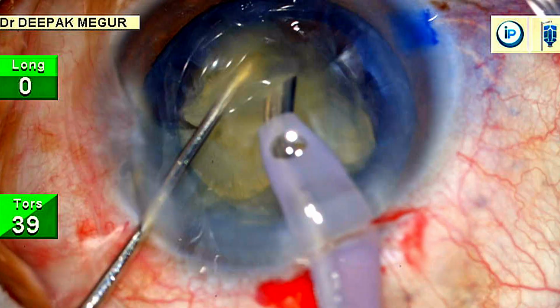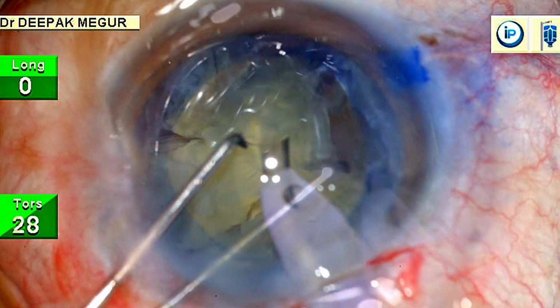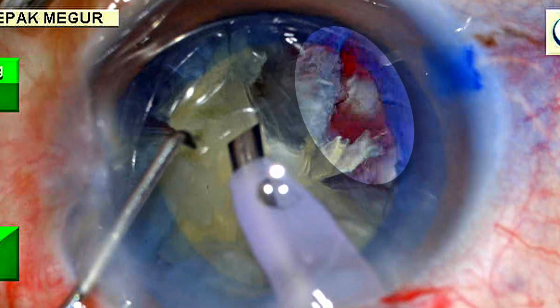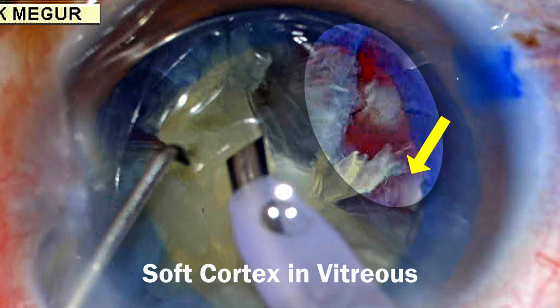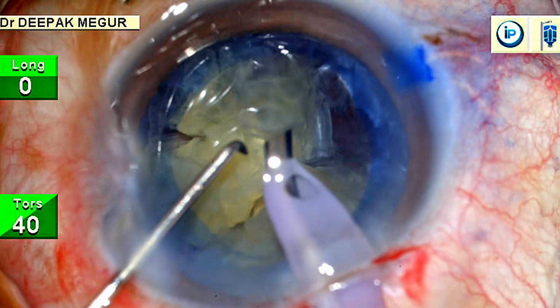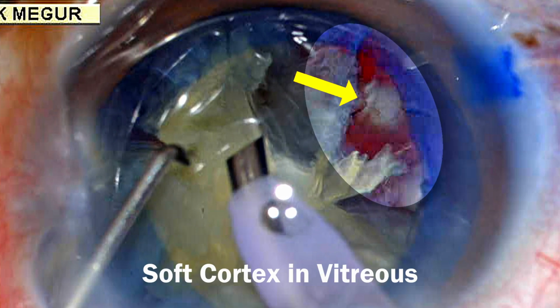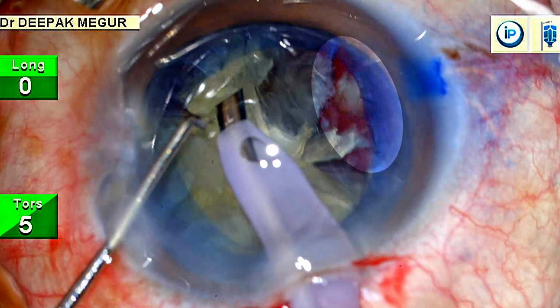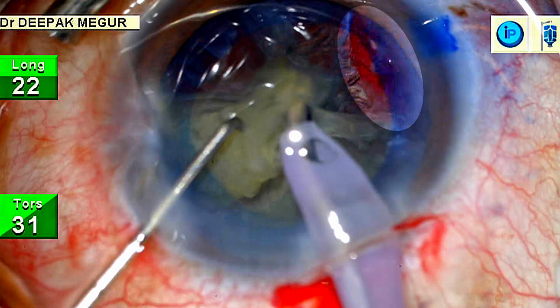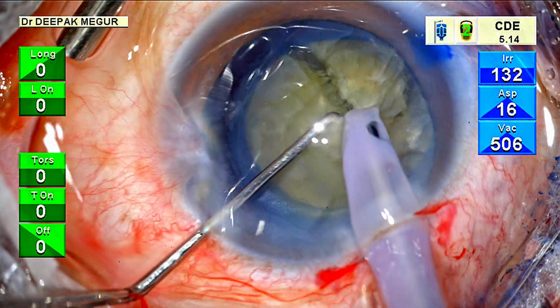So if we go back still, the first evidence which I could gather after viewing it multiple times was at this stage, where I can see 2 small fluffy cortex in the vitreous. Actually, when I was doing surgery, this was not visible at all because your focus is always on your phaco tip and the lens, but back behind this epinucleus, there are these 2 fluffy cortex. That suggests that the PC tear was there from quite some time. I was unaware and the nucleus was rotated.